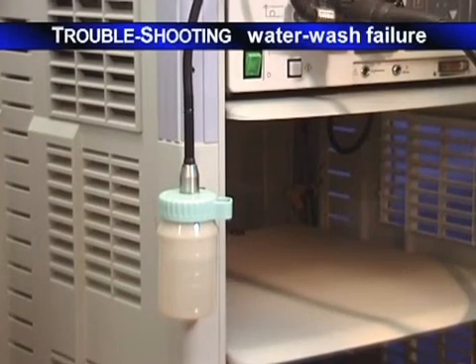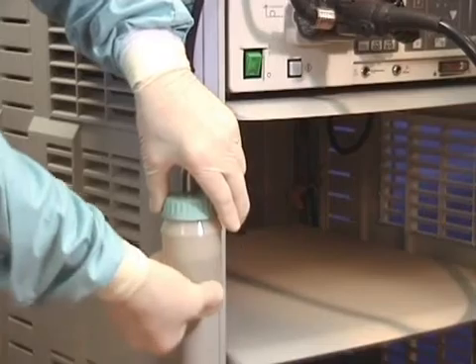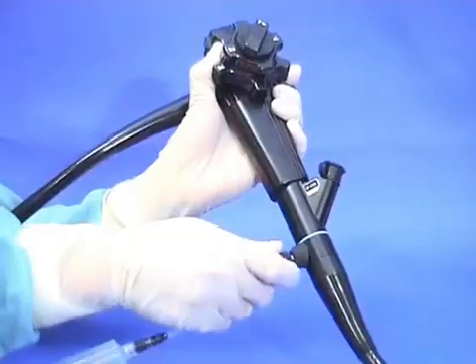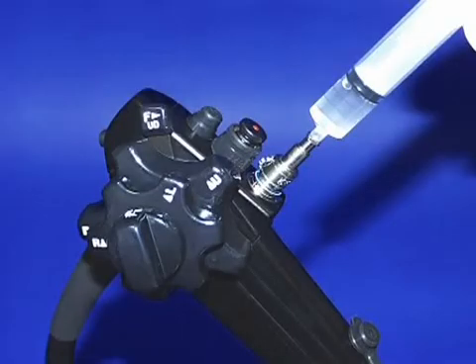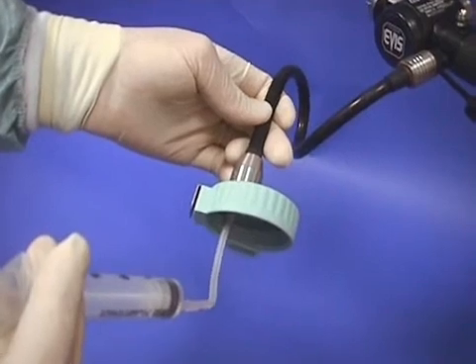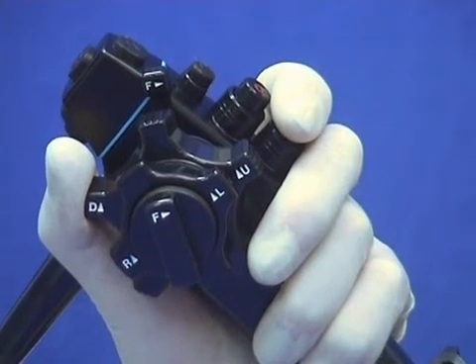If water wash fails and there's water in the bottle, check that the cap is screwed tightly. Then temporise, either by using the flushing syringe on an older instrument, or using the channel flushing device if available. As a last resort, it is possible to syringe flush up the water bottle tube, remembering to push the water button at the same time.